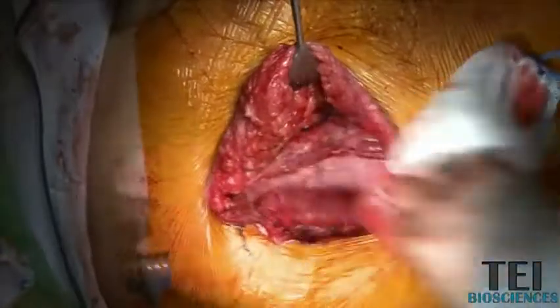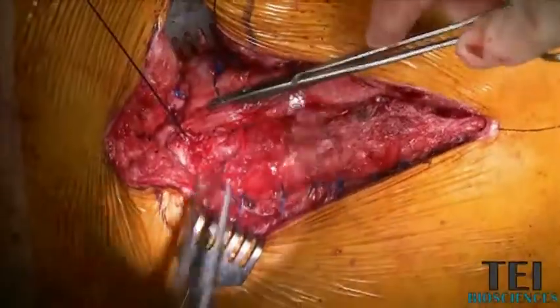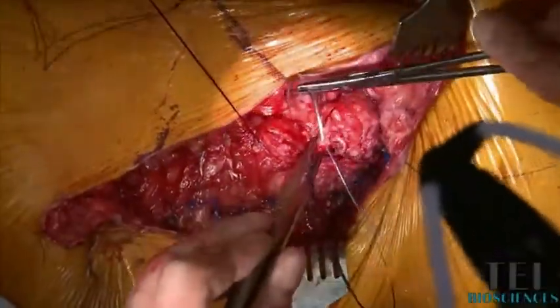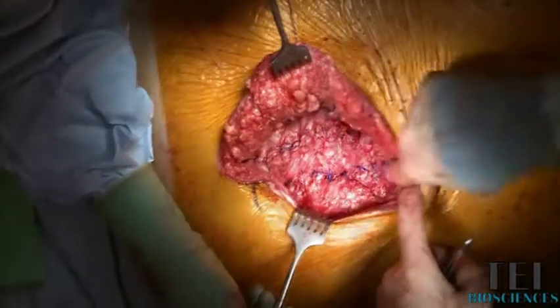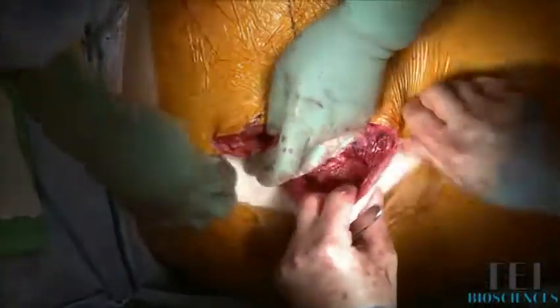Now we're going to close the fascia over the top. I use number one looped Maxon. Your suture line circumferentially goes around, including behind the umbilicus. At this point, you want to place your drains and close the skin.